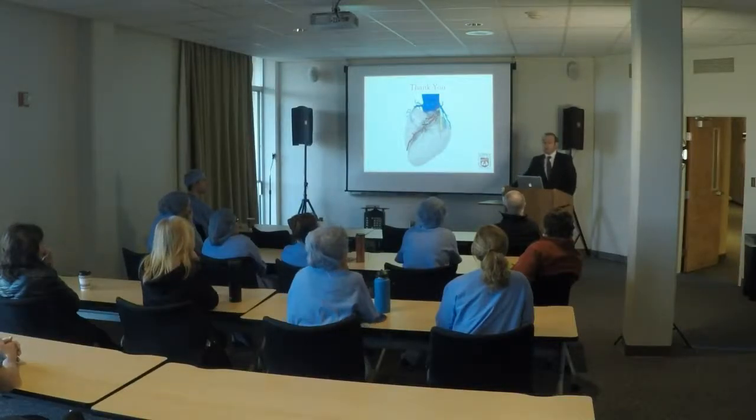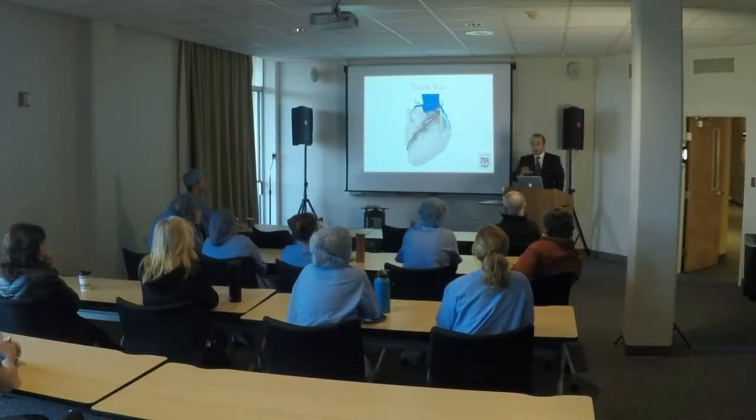Yeah, so that's a great question. So it's all about image quality, so I'm glad you brought this up. Because if you have poor image quality from the CT scan, we won't be able to perform high-quality FFRCT analysis. So image quality is key. And it starts with really beta blockade, especially, it depends on the scanner you're utilizing, okay? Perhaps with dual source scanners with higher temporal resolution, you can get away with slightly higher heart rates. But, for example, in many centers, it still is really important to get the patients beta blocked.